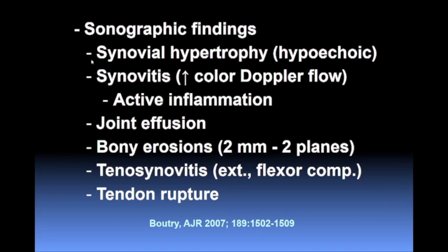So again, we look for thickening of the synovium. It's typically hypoechoic. We look for synovitis. So once I find a hypoechoic synovium, I turn on color Doppler, and this suggests active inflammation.